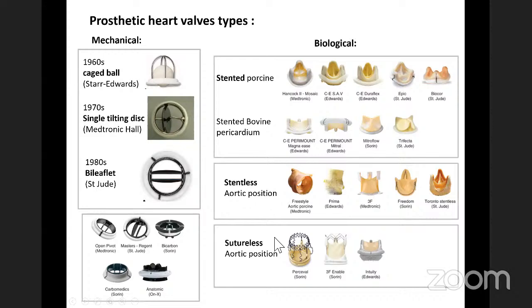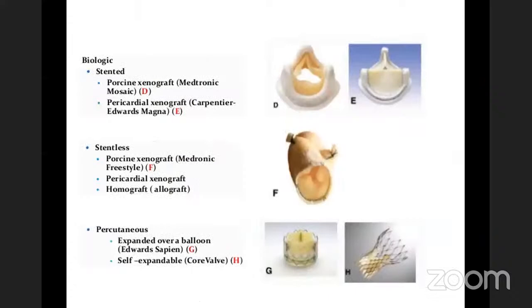It is worth mentioning that with all these advances, designs and modifications of mechanical prostheses over the past decade, the use of mechanical aortic valves has decreased worldwide, and the trend keeps on decreasing. This is attributed to the improved longevity of tissue aortic valves and the introduction of TAVI, and also the potential valve-in-valve TAVI in case the tissue valve fails in the future.